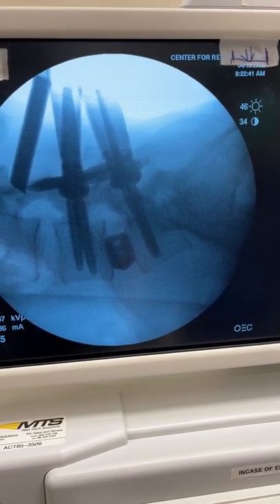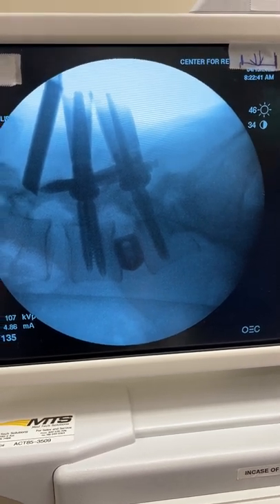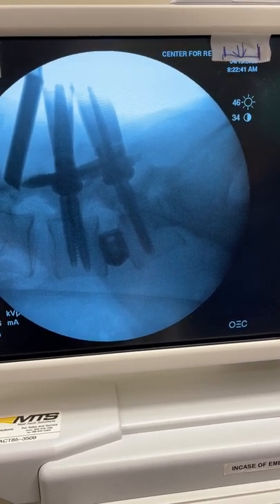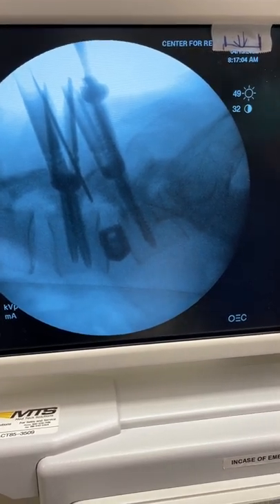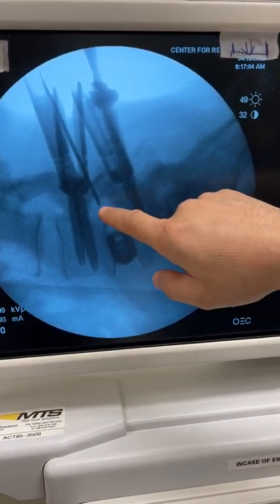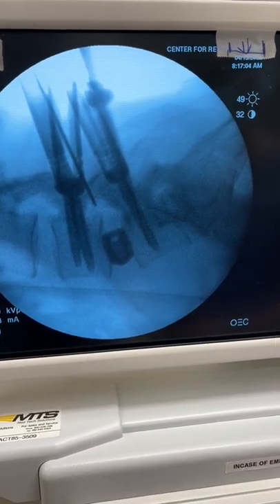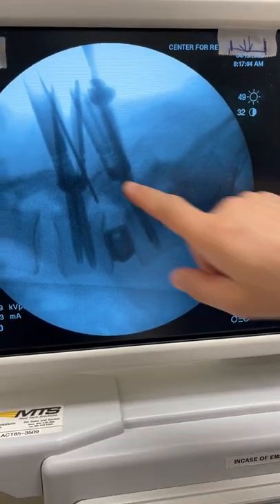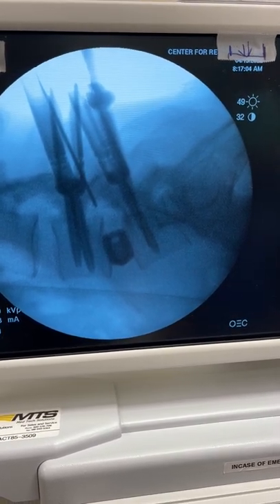One picture I particularly want to highlight is when I'm stimulating the screws — this picture. I think this is a very crucial picture. Here we are placing the neuromonitoring probe extra-foramenally into the foramen and stimulating at 5 milliamps, and we get a signal of L5 on the right. This means that this segment has to be considered L5-S1, because that's the L5 nerve that's exiting at that location.